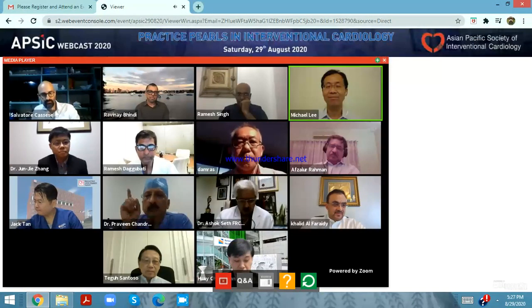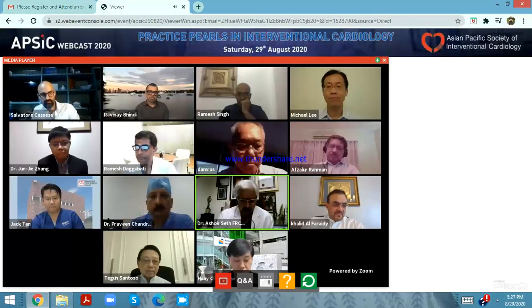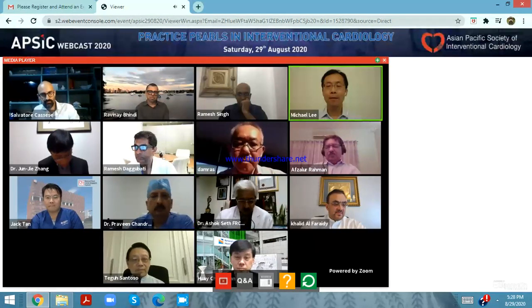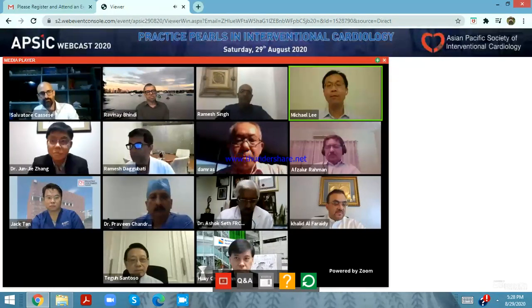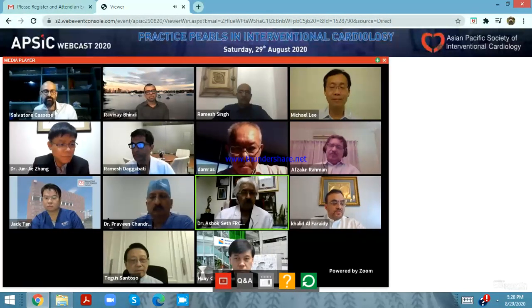Right. What about the patients where there is no OCT evidence of calcium fracture after IVL? Is it a failure? Sometimes we need to repeat the procedure to create that fracture. It takes time, it takes pulses, it takes energy, especially for very deep, hard calcium. Hard and eccentric calcification. And by the way, calcium nodule may not respond to IVL.